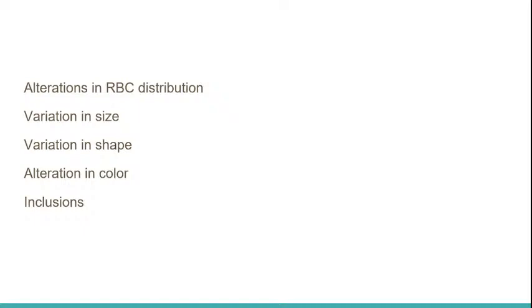Okay. Now, in terms of taking the ASCP examinations, this particular presentation that you're going to see is extremely important, mainly because you will get questions like identify the cell. So you must be able to either identify the cell or identify the abnormality. You'll get questions like these. All right. Sometimes they will show you pictures. They will show you a picture of a general blood smear, and then you just need to tick the boxes. What are the cells that are abnormal? What cells do you see here that are abnormal?